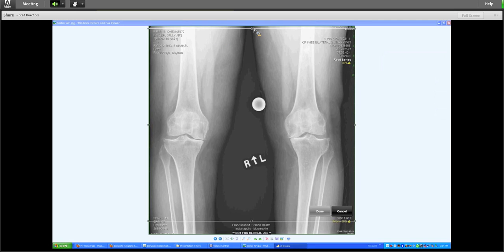Some folks, for maybe some privacy issues or whatnot, are going to want to come down and crop below that information. The point is exactly what I made a minute ago about remembering the steps from the last step. So wherever I crop this particular X-ray, the next time I open the next X-ray, those same crop marks are going to be exactly in place, assuming you're using the same digital X-ray system and the same formats are coming in. Once you get your crop set, you'll probably be able to keep it set and the work process will just flow.